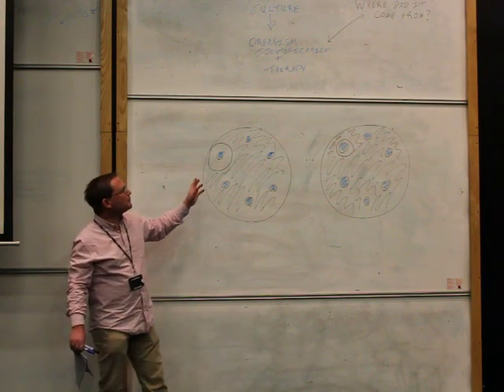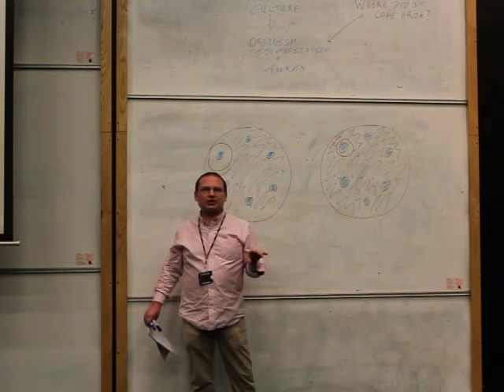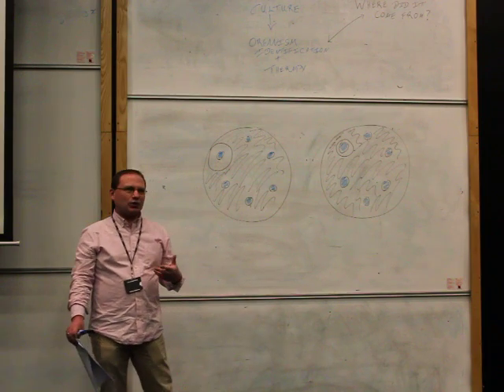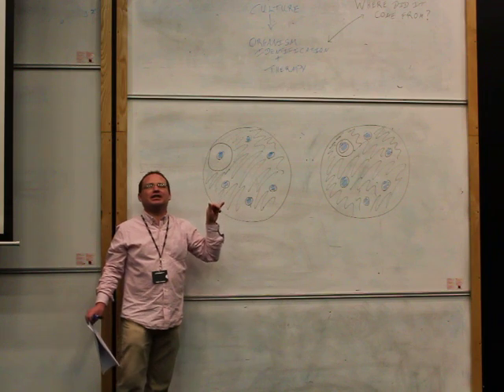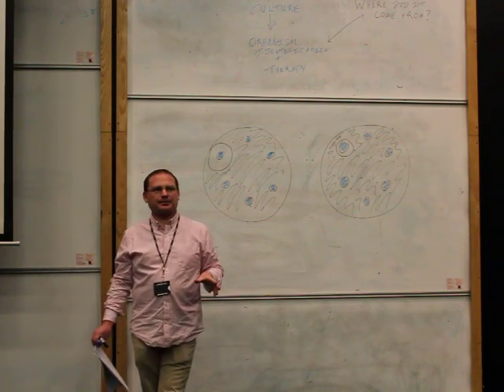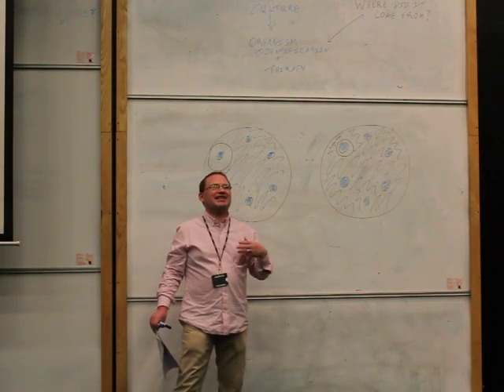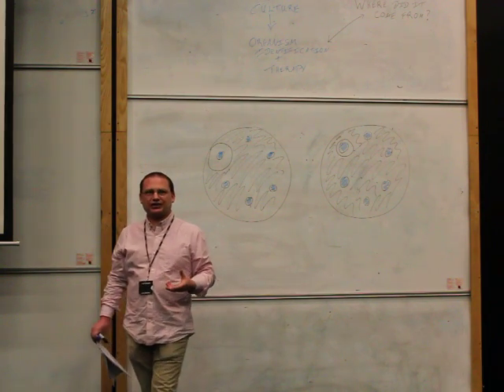Okay? You measure the same zone size on your test organism and compare the two. If the test organism has a zone size that is equal to or greater than the zone size of the control, it is sensitive. If your test organism has a zone size that is smaller than that of the control, it is resistant.